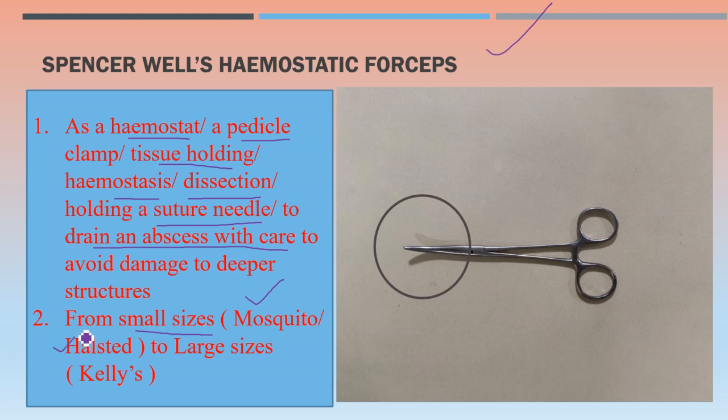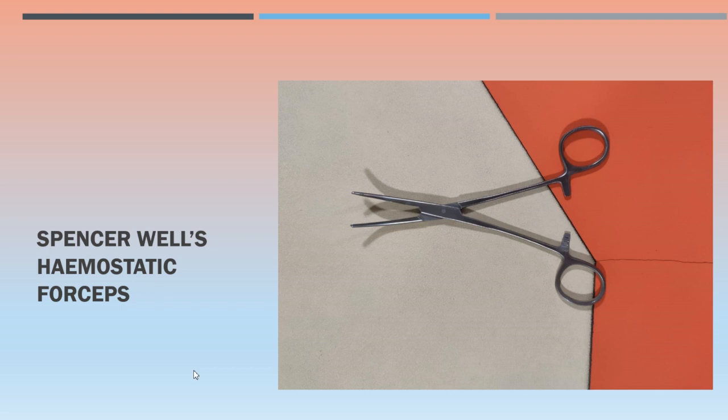If these Spencer Wells hemostatic forceps are of small size, they are known as mosquito forceps or Halsted forceps. If they are of large size, they are known as Kelly's forceps. We have already covered mosquito and Kelly's in previous videos. This is how the open Spencer Wells hemostatic forceps looks — focus on this end; these forceps have locks.